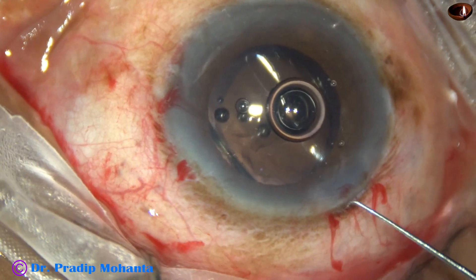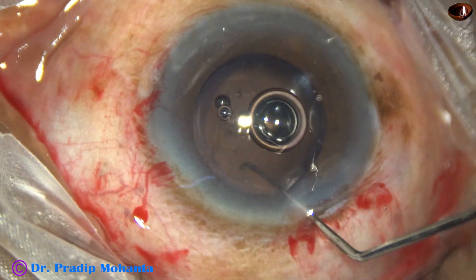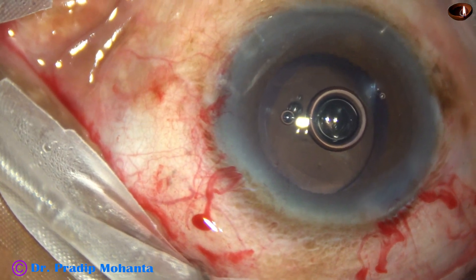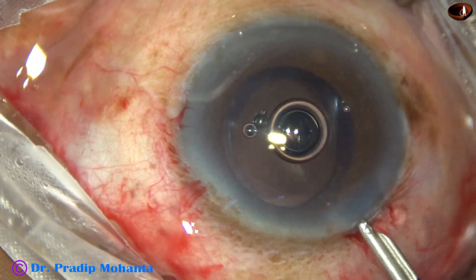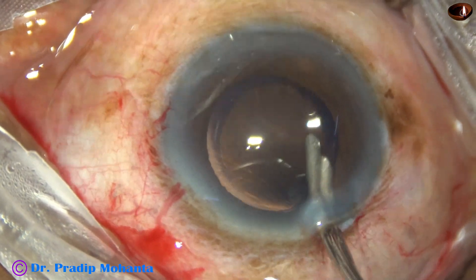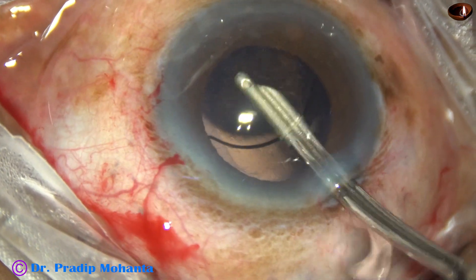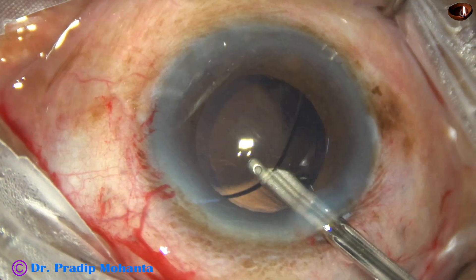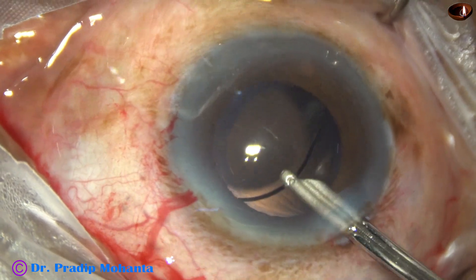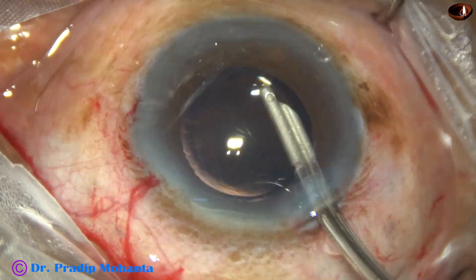The lens goes into the capsular bag. The lens is oriented in such a way that I can go under the lens and irrigate the capsular bag to remove the visco trapped between the lens and the posterior capsule. This is irrigation of the anterior chamber. I go behind the lens and irrigate the capsular bag. A lot of visco molecules come out by these maneuvers.